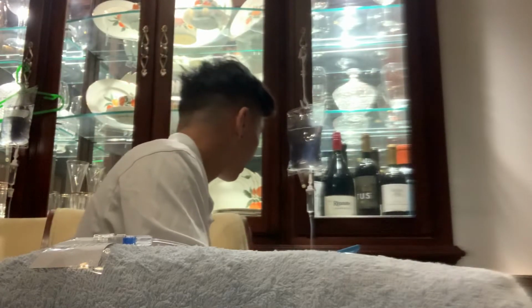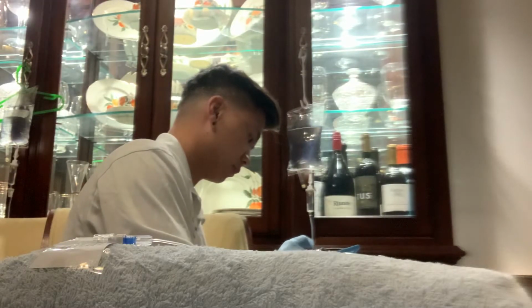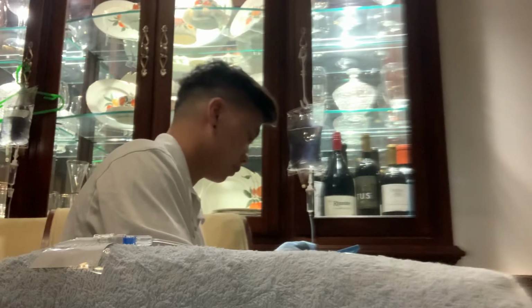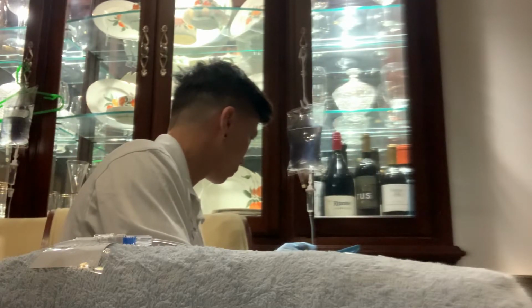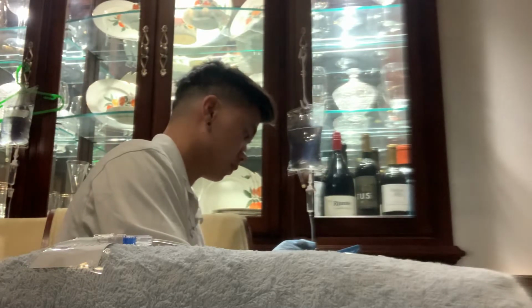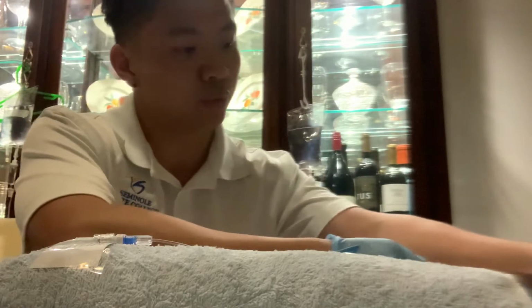The roller clamp. Okay, so I've adjusted it to 21 drips per minute.